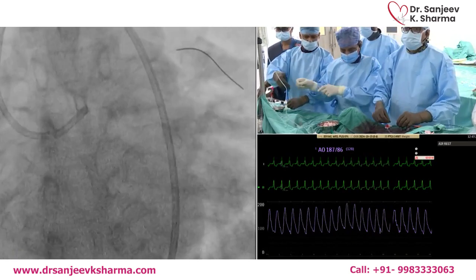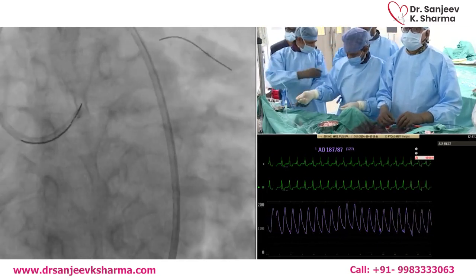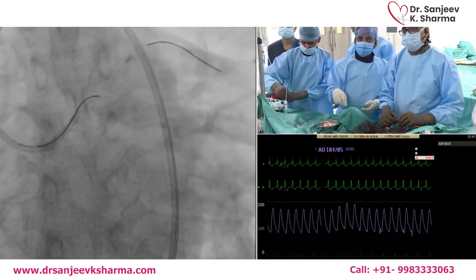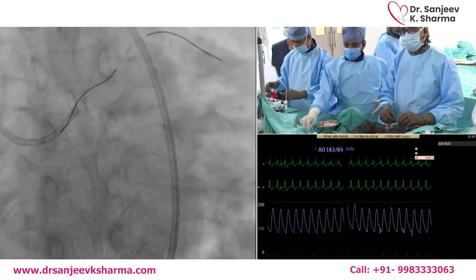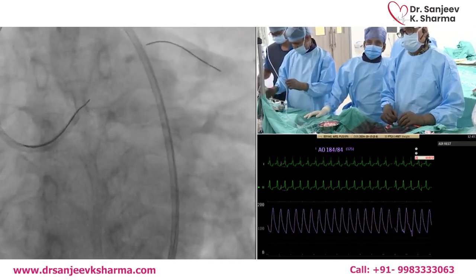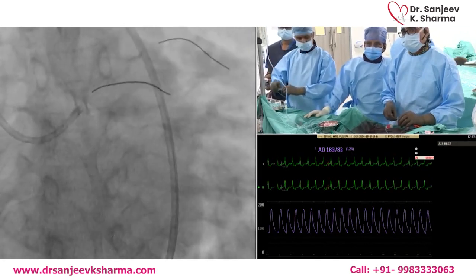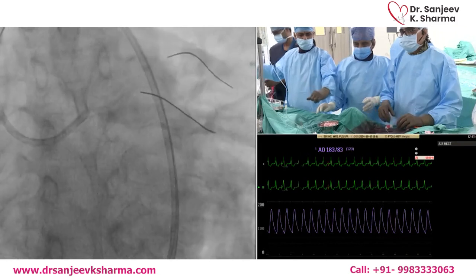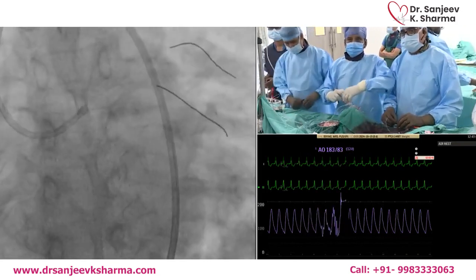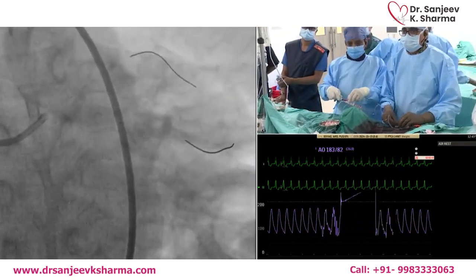If the orbit is not making headway, how long can we stay in one area? Until it makes a sound. There is a sound that tells you to stop and give it a break. How you utilize that time is up to you. You can keep moving, or you can be stationary, or you can go one way and then come back. I usually don't like to go and come back. I like to go one way, stay there, take a rest, come back, stay there, go back again. So I use a full one way each time.